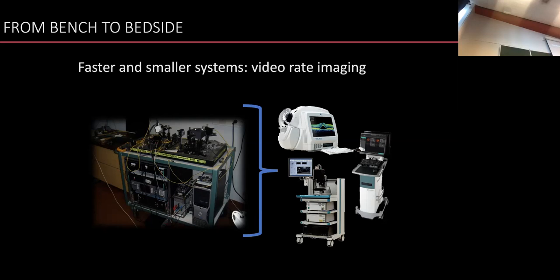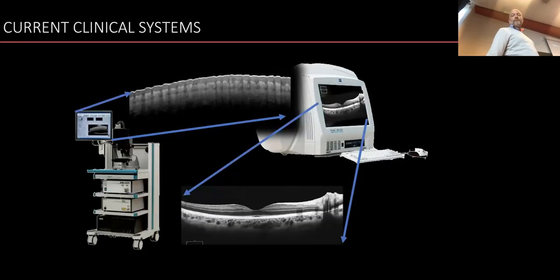We have systems like this one, and I will show you the details later, that we use in endoscopes because it has a very tiny catheter. You can interface this catheter with the system. It has optical technology in the tip, and we can image tissue. And we have things more for outside the human body on a cart with a handheld scanner. But it all started with big open air setups.